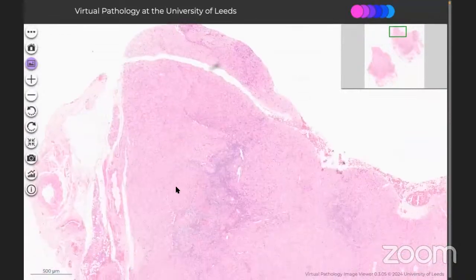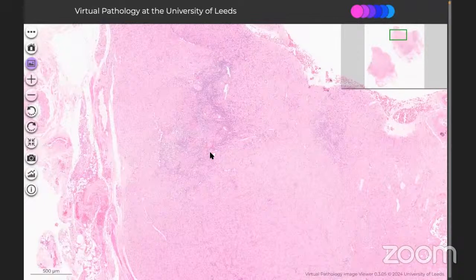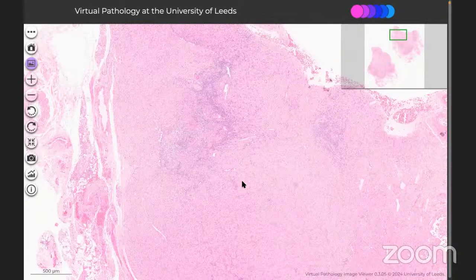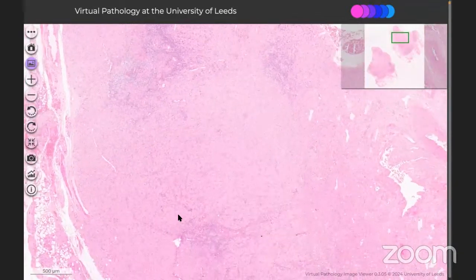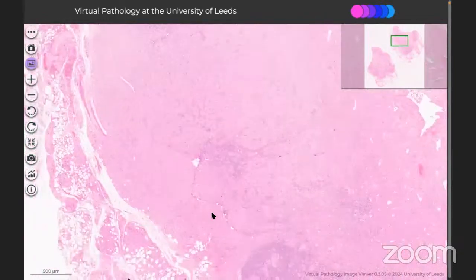So you should say that it is a granulomatous lymphadenitis, and I suspect some kind of tubercular or atypical tubercular infection. It may be some sexually transmitted disease like chlamydia and all that. So these are the differentials, and you will work towards it.